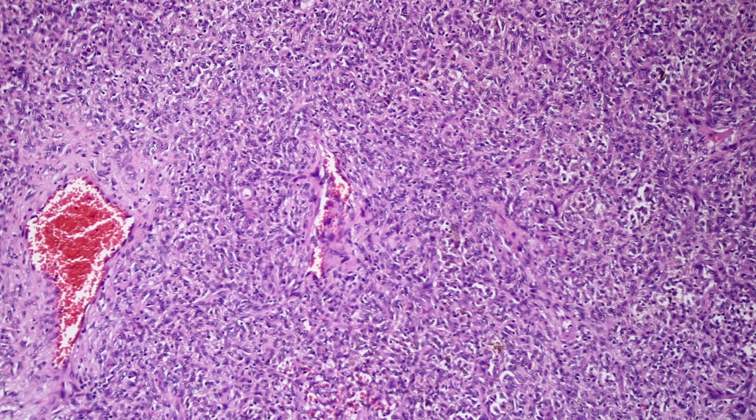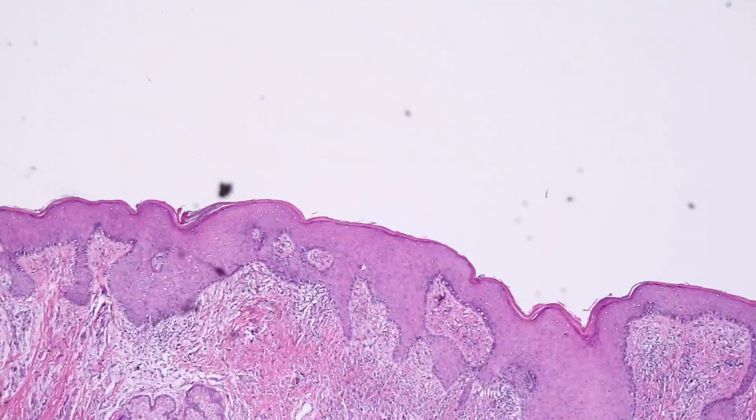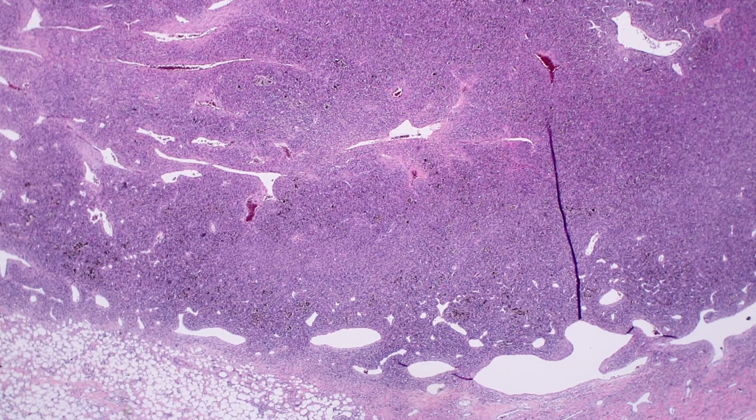And if they're only biopsied superficially, they'll often recur. And we say recur, but what we really mean is they'll keep growing. Most of the time, they're not locally aggressive lesions. They're just big. So if you biopsy just the top of it, say if you did a shave of this thing up here, well, guess what? The patient's still going to have several centimeters of tumor left underneath in the dermis. So of course that's going to keep growing.